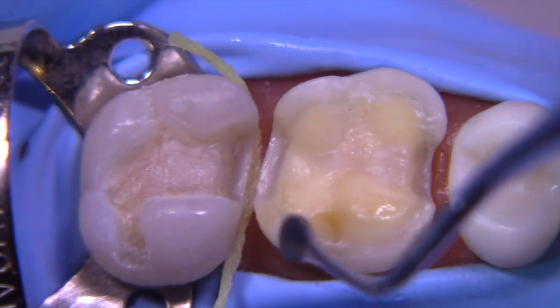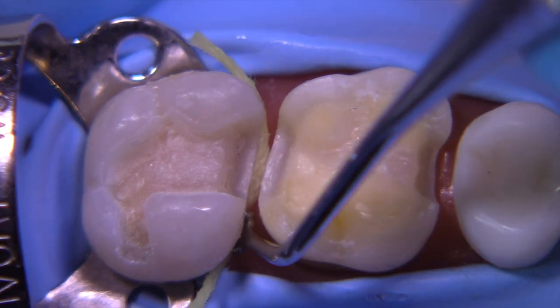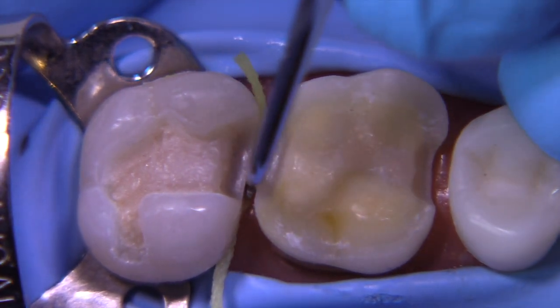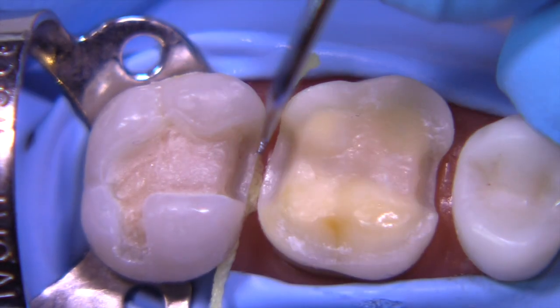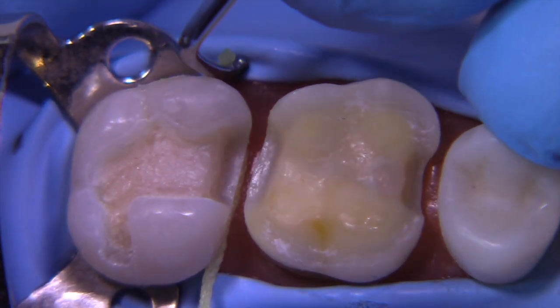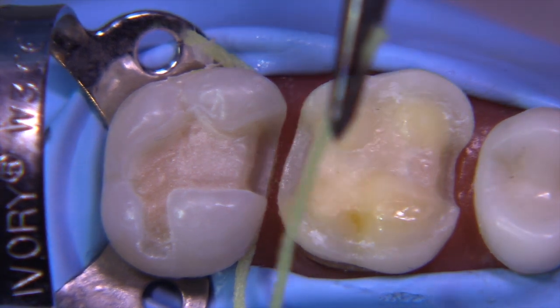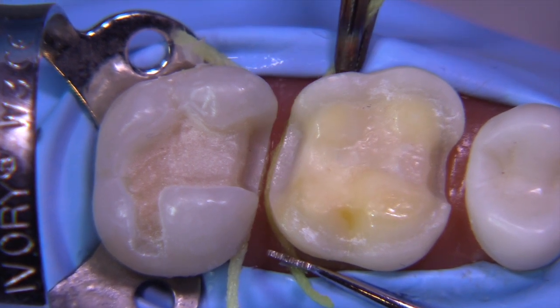I'm going to place three cords of size zero in each of the box areas. I like to start on the line angle area and then take the serrated cord instrument and push it back from where I just came from, to help cinch it into position rather than pulling away and having the cord come up out of the tissue where we anchored it. This works really well — pushing the cord away from where you just started placing it. We're going to repeat this process for the distal box on the MOD and the mesial box on the MOD, all being done with a zero cord.